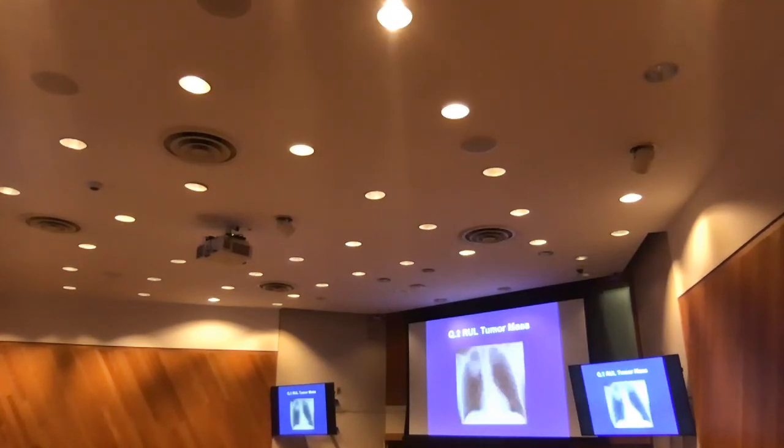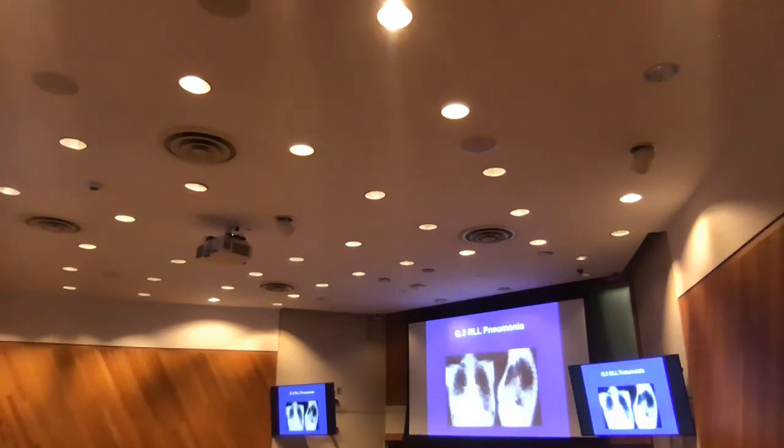What is this? Right upper lobe tumor, because that's where the tumor is. The right side is rounded, lobulated. Pneumonia will not look rounded generally. The right upper lobe tumor, most likely. Rounded. Right? Give yourself 10 points if you got that.